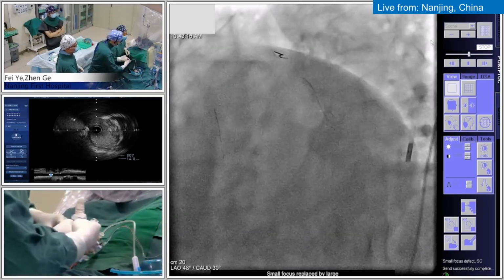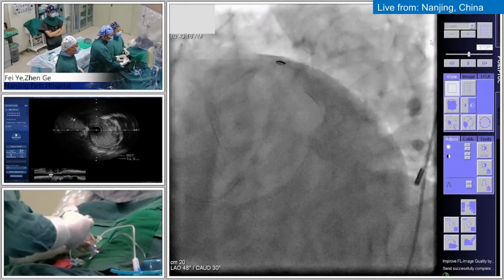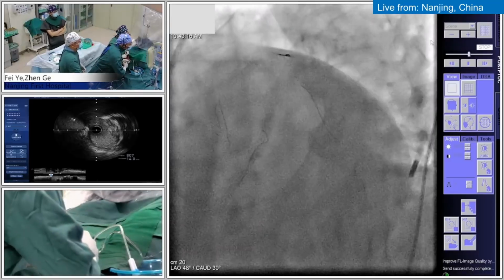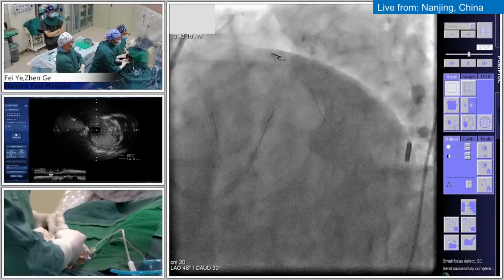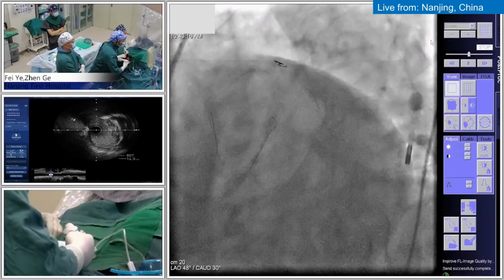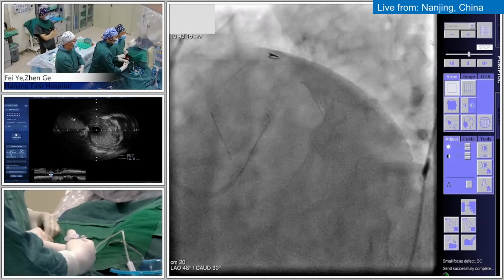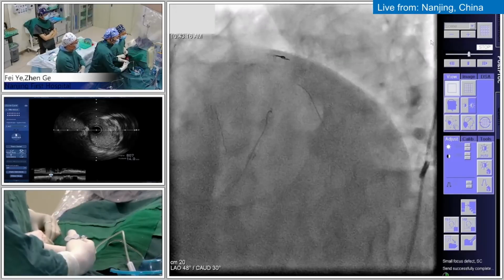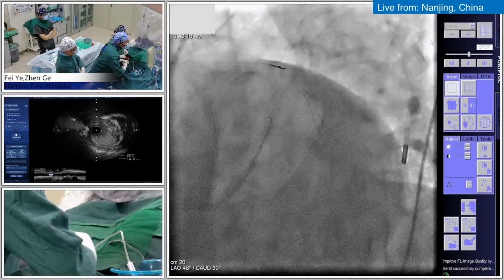Probably I have to, based on the post dilate of the LAD and the distal left main, check the ramus and the circumflex ostium to make sure if the plaque moves into the side branch ostium, to decide on post kissing balloon inflation or not.